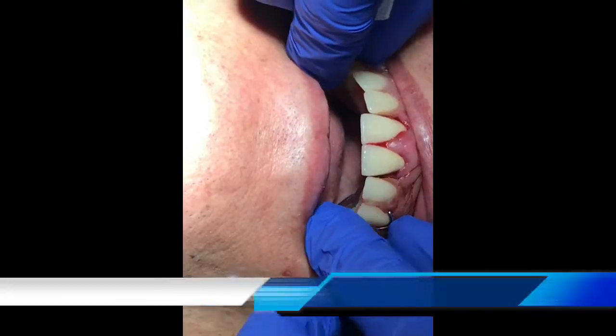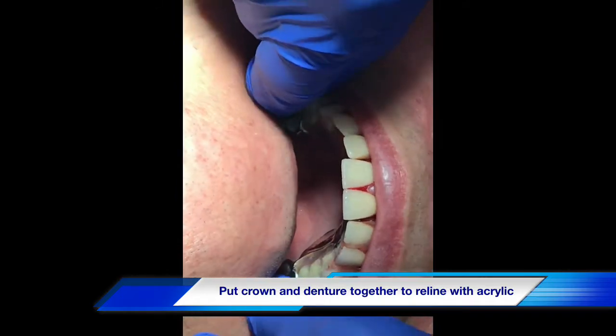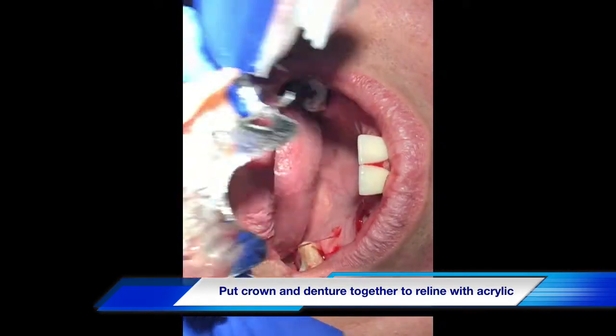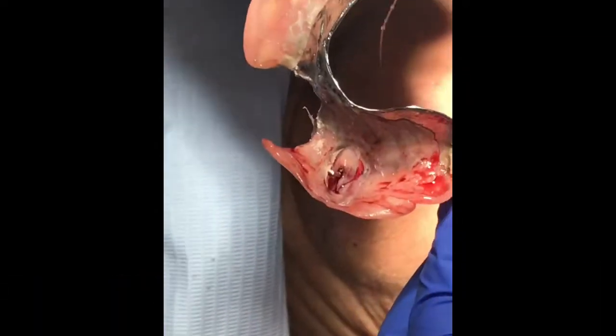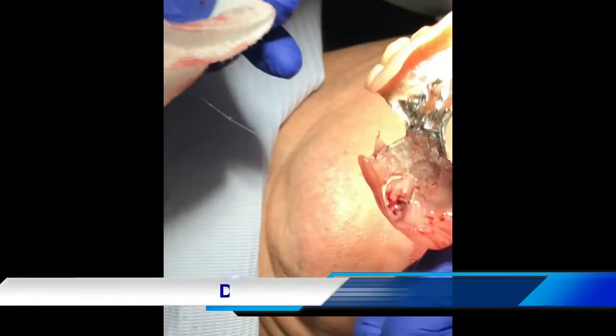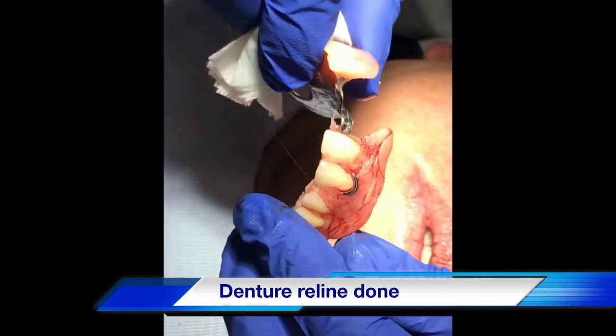Now we put it all together — we reline with acrylic material, wait for about 5–10 minutes for the material to set, then trim off the excess material and polish the patient's denture.